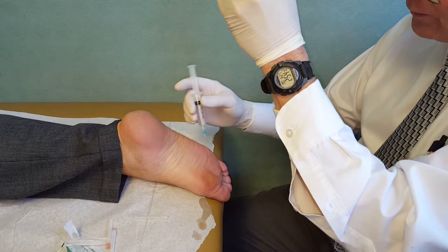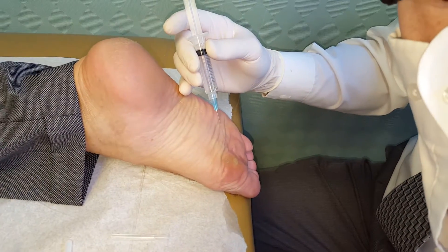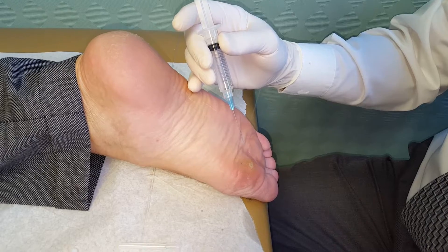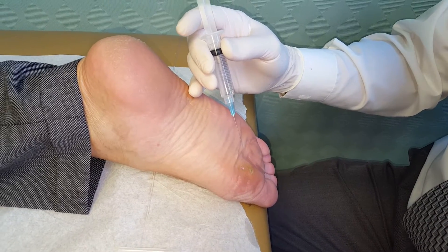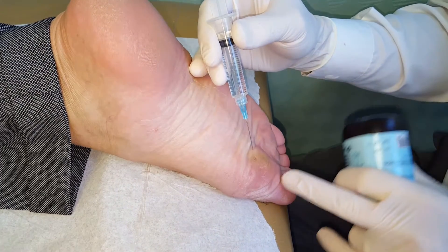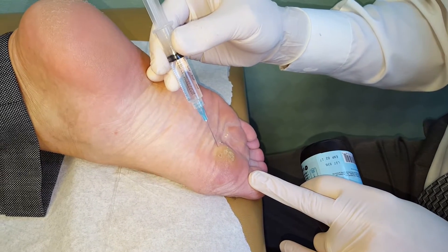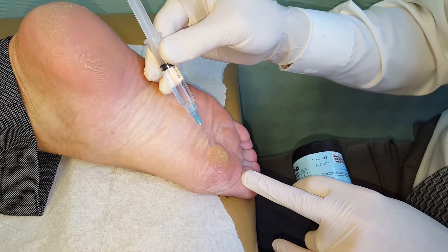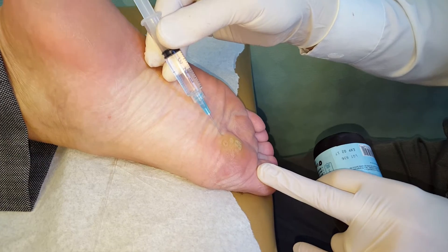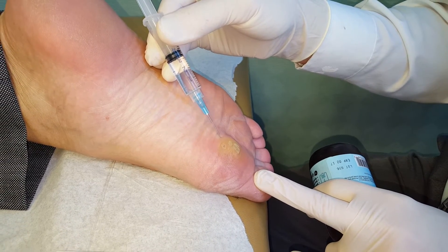Here we go. I get it nice and frosty and cold. Just relax. Nice and cold. You're going to feel a burning sensation. Doing great. Just relax there.